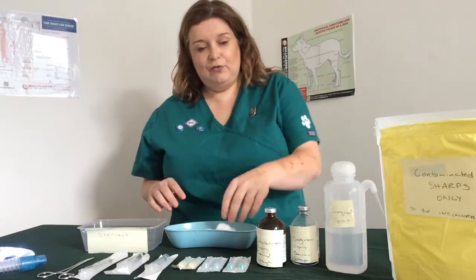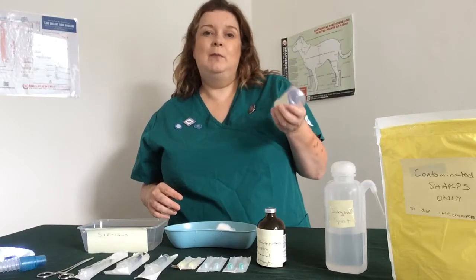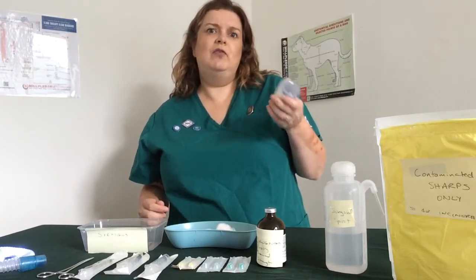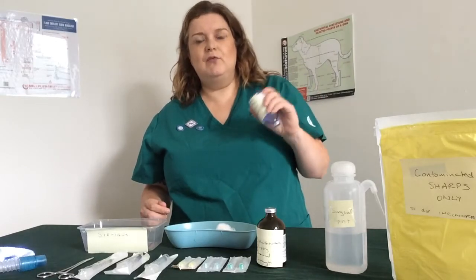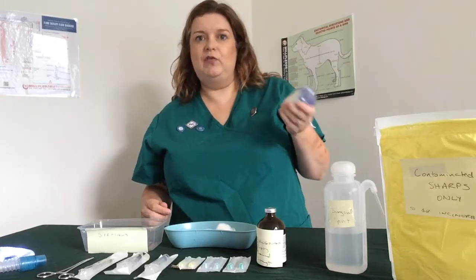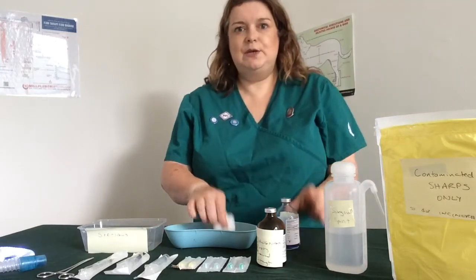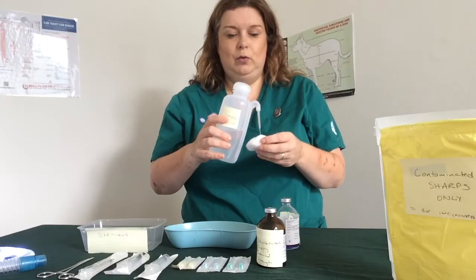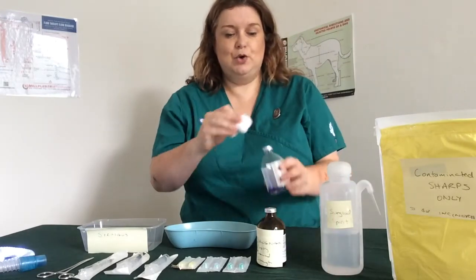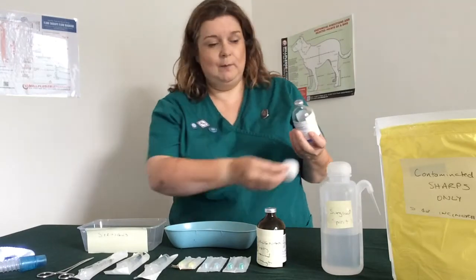You're also going to need to make sure, once you've done that, that you invert it and shake it. At the moment this is in quite a few of the tasks, whether it's an antibiotic or not, but obviously in practice you'd be shaking something like an antibiotic that's in a suspension that needs to be remixed. What you also need to do is clean the top. So surgical spirit, cotton wool, top is cleaned, and you can do that before or after you shake, that's absolutely fine.